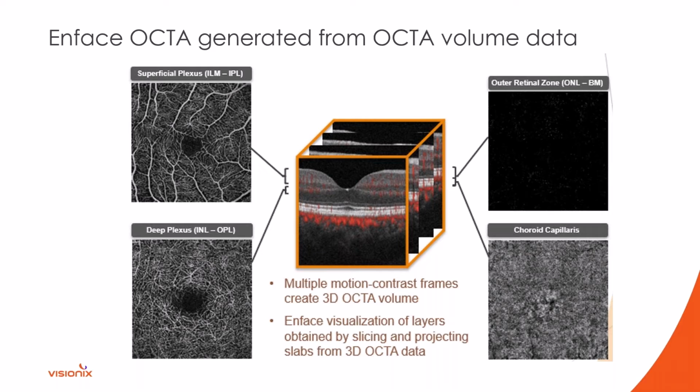Well, if I was in person, I'd show you a notepad or a book of sticky notes. You're looking at the first sticky note, let's peel that away, and then you're looking at a little bit deeper sticky note, then peel that one away, and now you're looking even a little bit deeper. So you're going layer by layer through that retina, and that's what en-face imaging does, and that's how OCT angiography works.